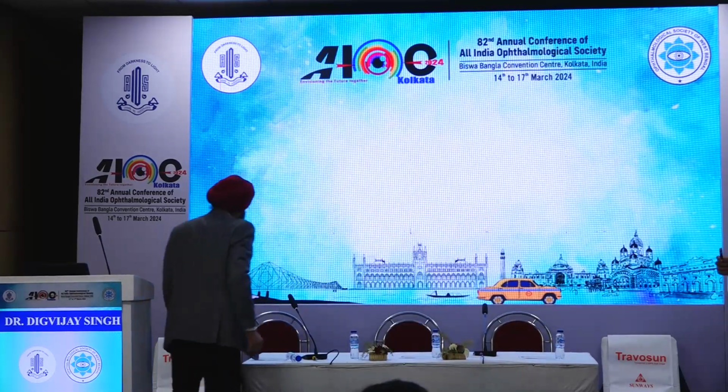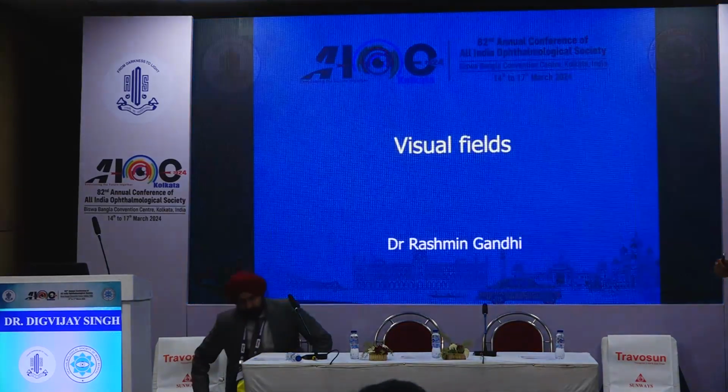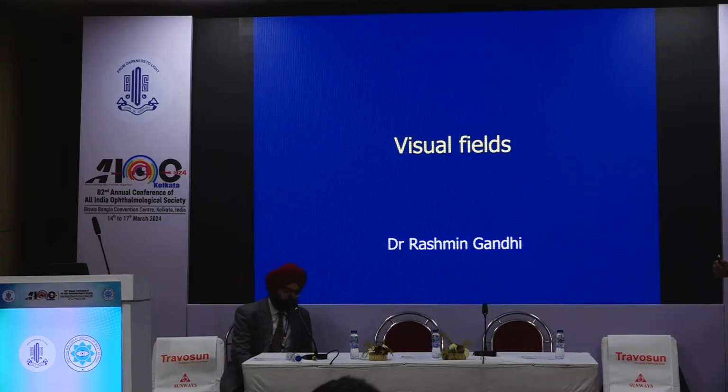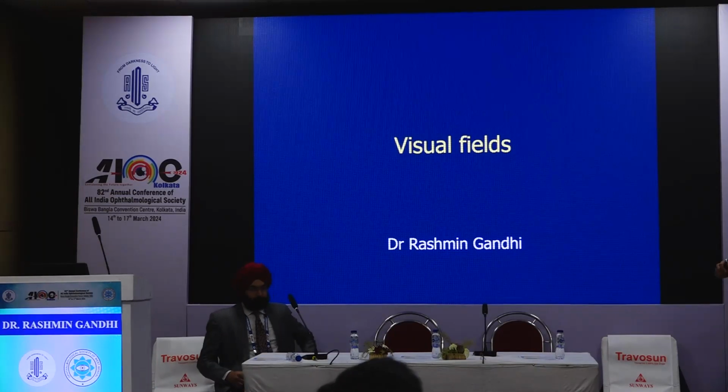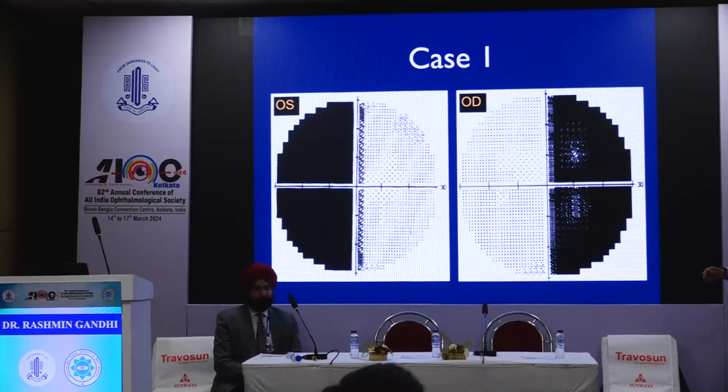So, there are a few disclaimers. One, neurological visual fields ideally should be tested on a kinetic perimetry, but they are not very popular, not readily available. Confrontation test is something which we should all know and deploy even in our general ophthalmology practice, because it can really screen out the serious problems, and that's something which Ankur already spoke about. So I'll restrict my talk to the automated static perimetry.